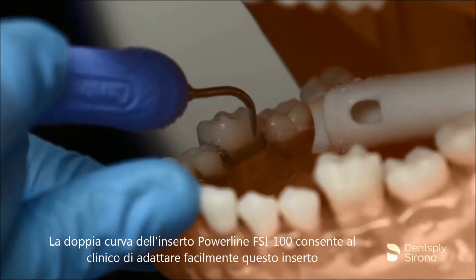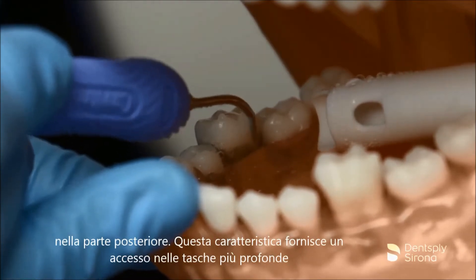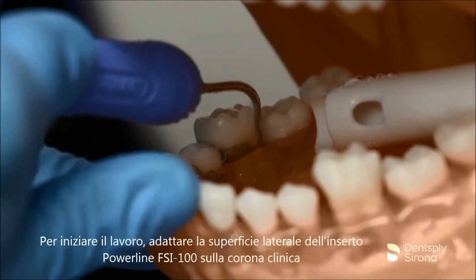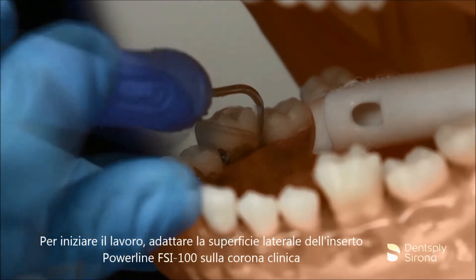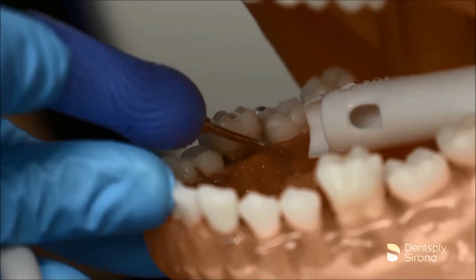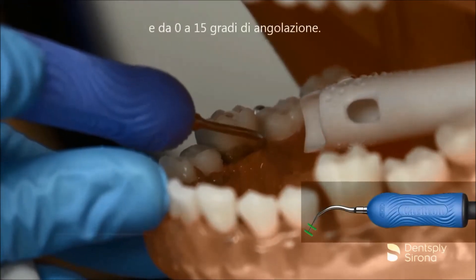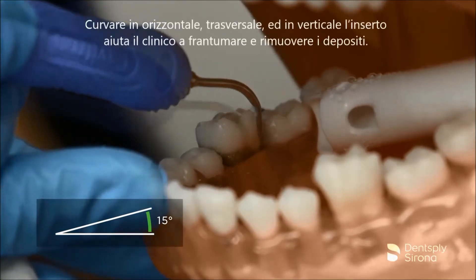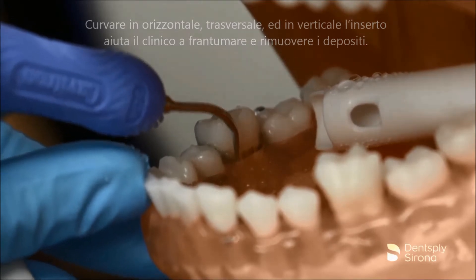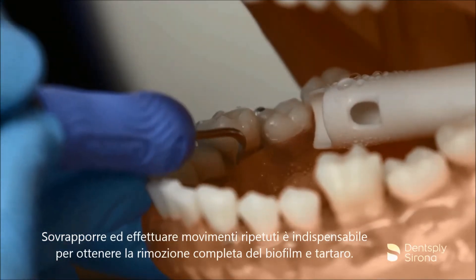The double bend shank of the Cavitron FSI 100 allows the clinician to easily adapt this insert in the posterior region, providing access into deeper pockets of the interproximal spaces where heavier deposits may be encountered. The clinician begins instrumentation by adapting the lateral surface on the clinical crown and uses the back and/or face of the insert tip as needed. The clinician demonstrates a transverse oblique approach, maintains 2-3 mm of adaptation and 0-15 degrees angulation, utilizing strokes in the horizontal, transverse, and vertical orientation to fracture and remove deposits. Utilizing an overlapping methodical stroke pattern is essential to achieve thorough removal of biofilm and calculus.